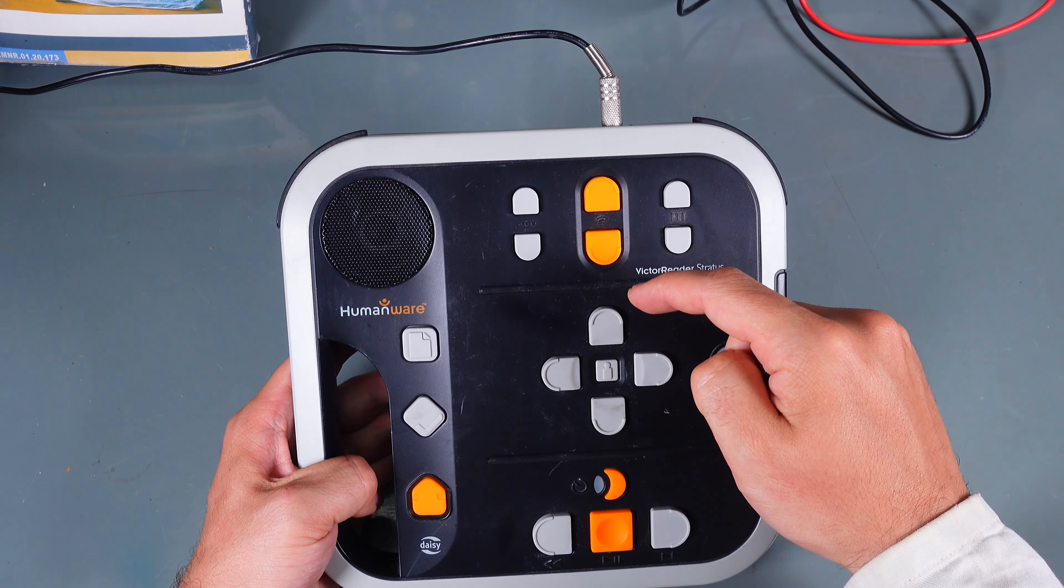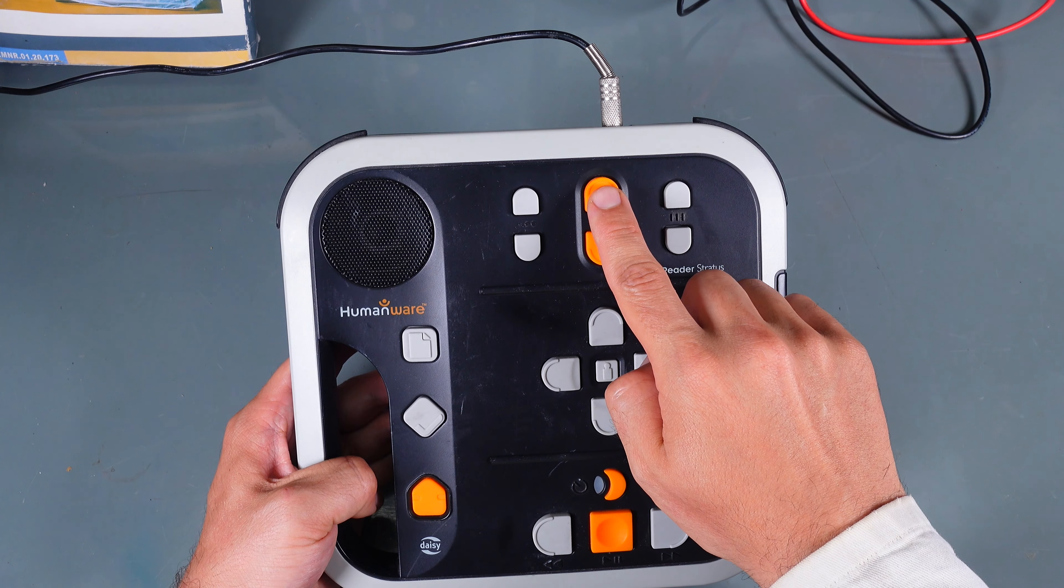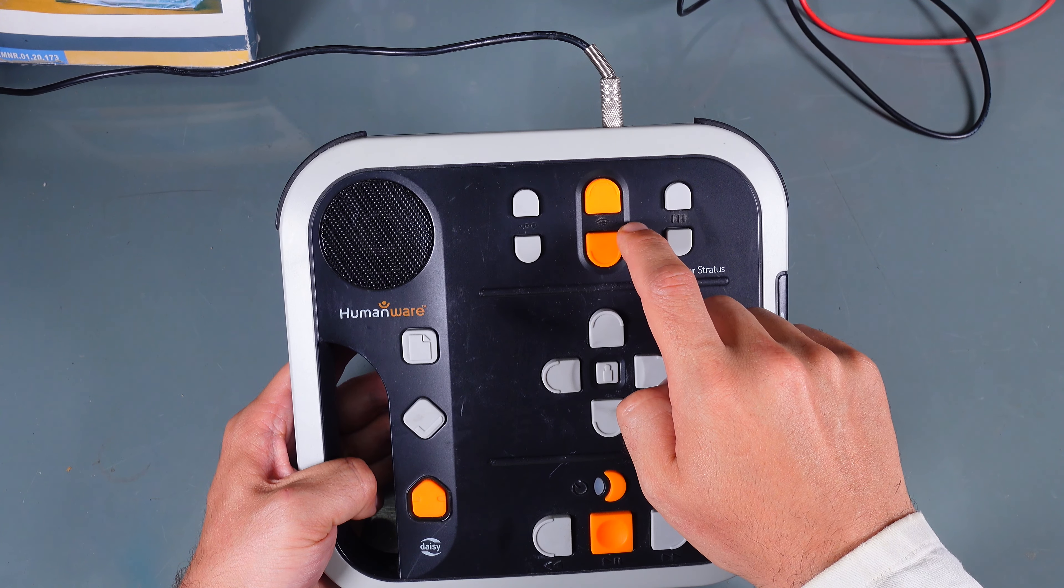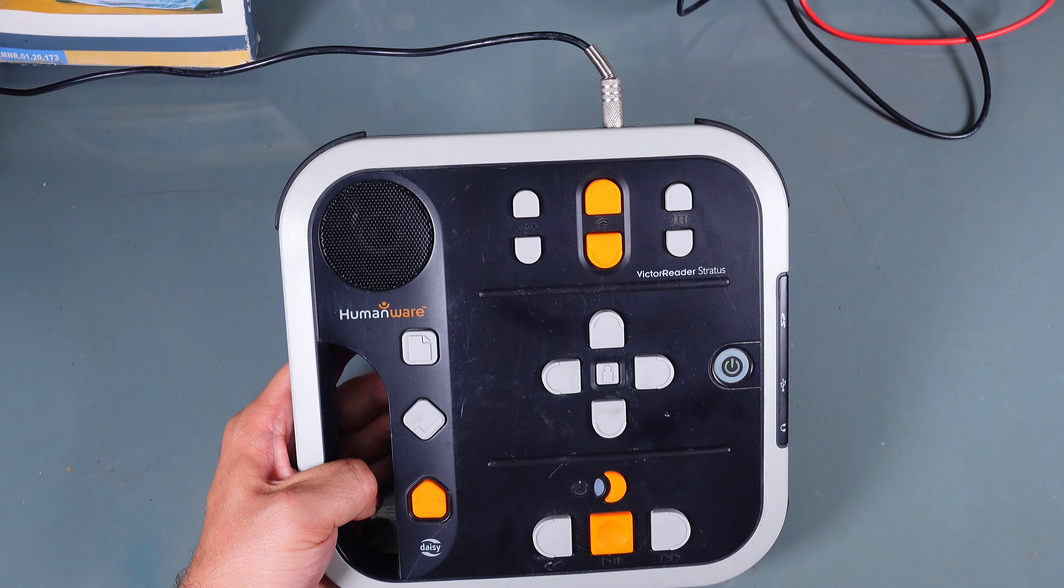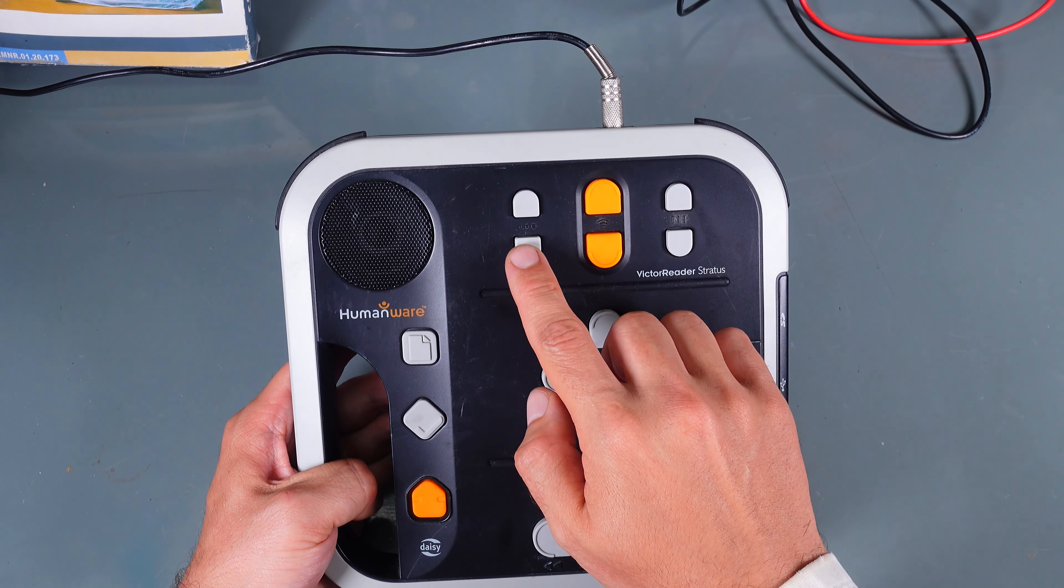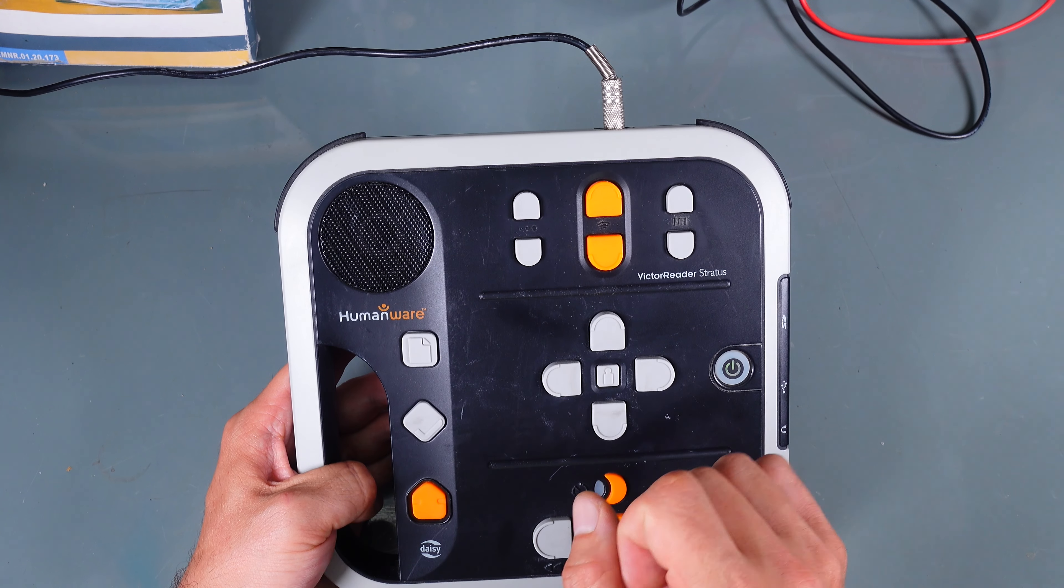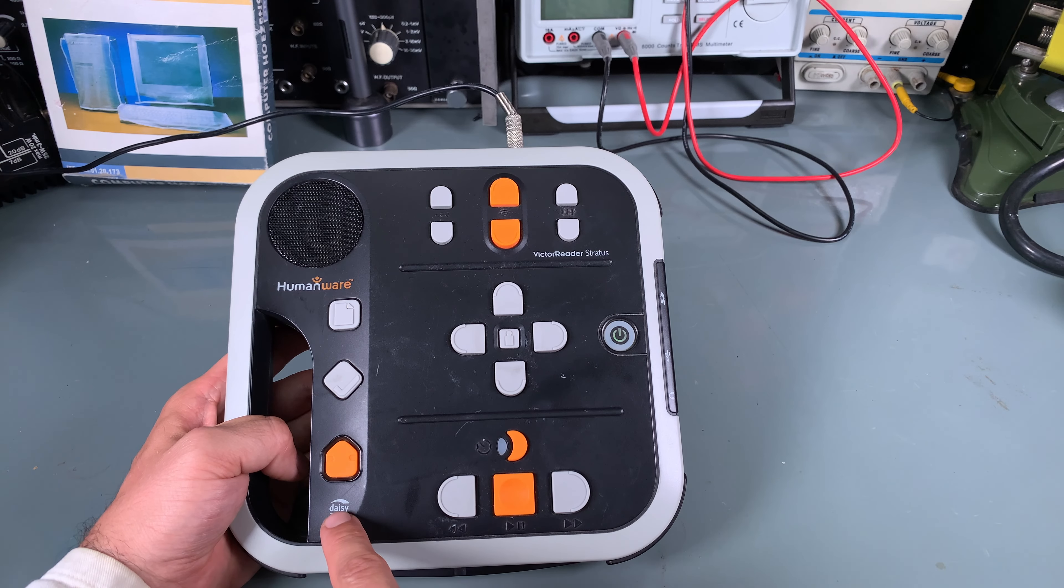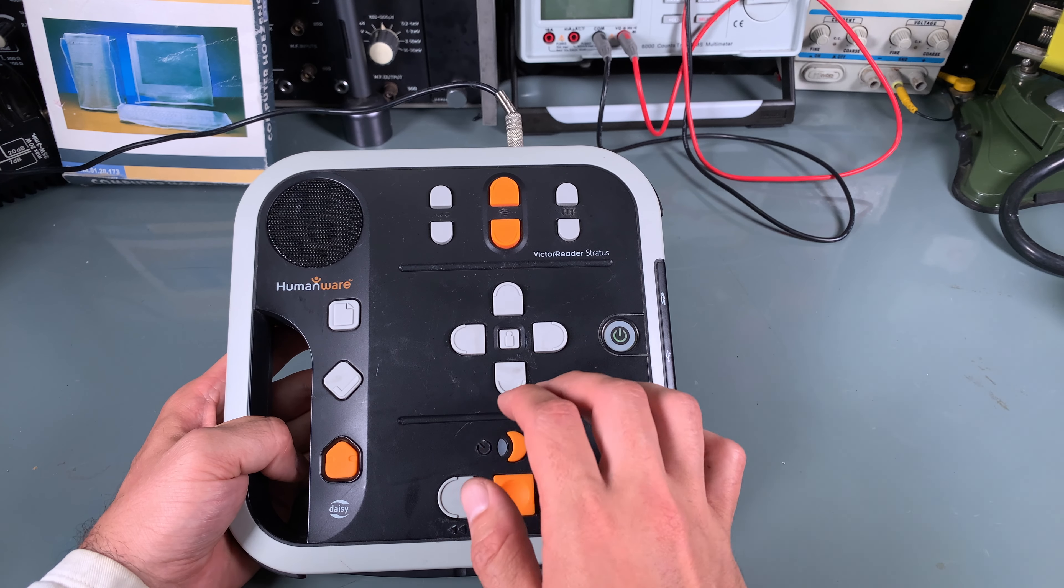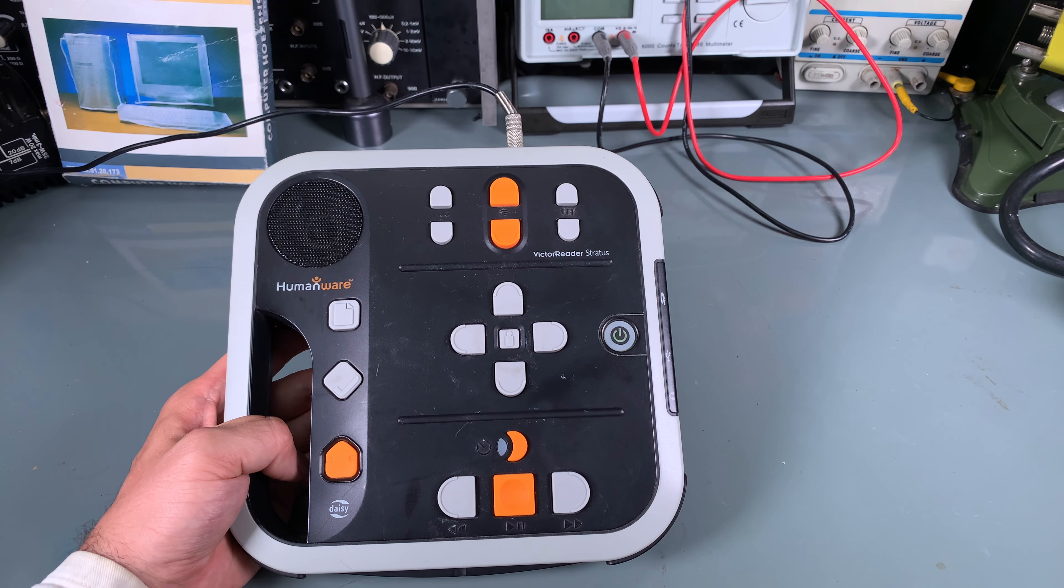This is the volume adjustment, and if I change it, the reader will announce the value. We've also got adjustments for books like pause between words and reading speed. By using books in the DAISY format, you'll be able to navigate through chapters using all these buttons.